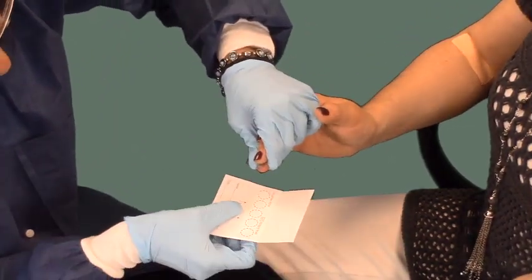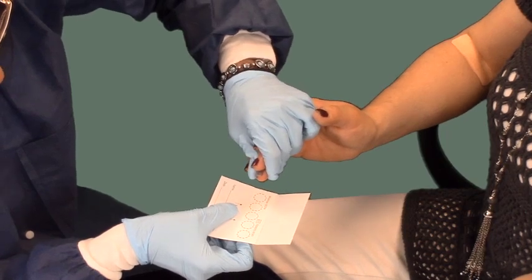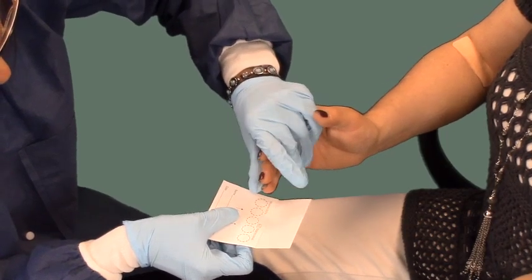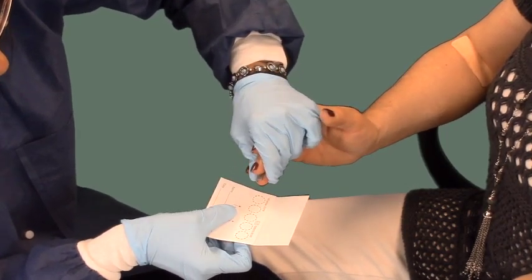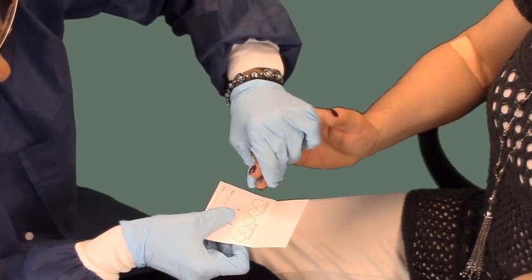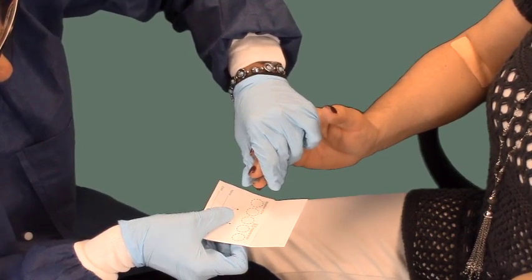Turn the hand downward and using gentle side-to-side squeezing, not top to bottom, which will block blood flow to the fingertip, allow the blood to free flow onto the filter paper card. Do not touch the blood drop to the card before it falls.